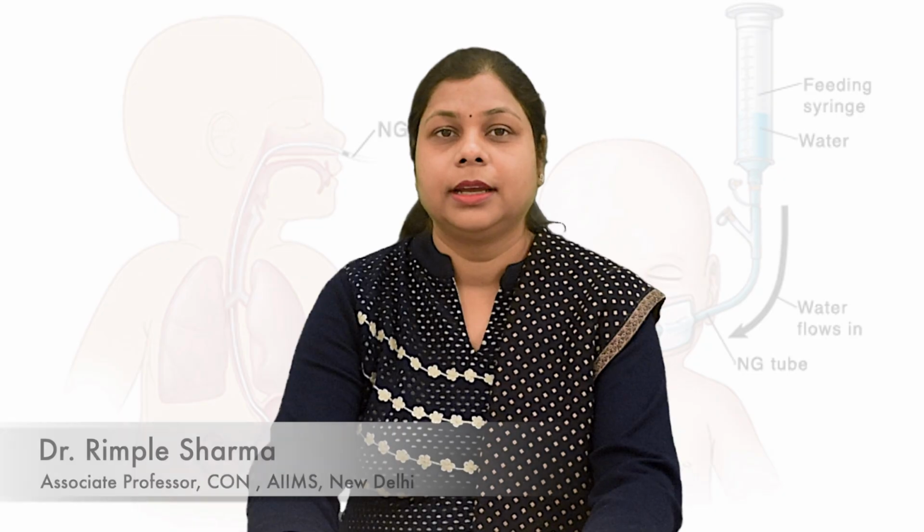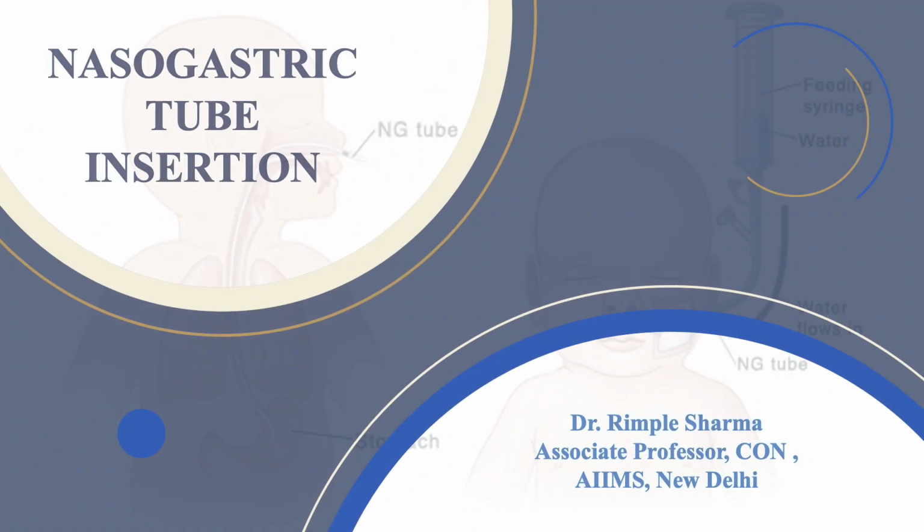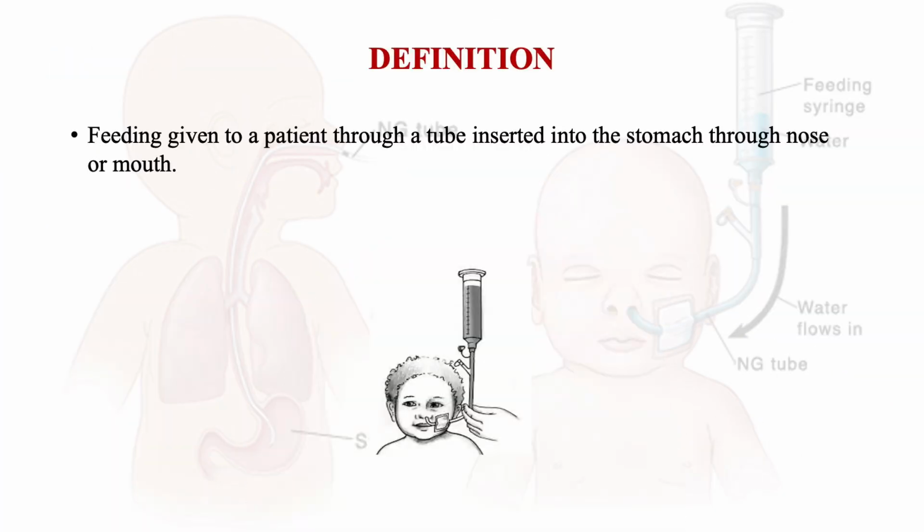Welcome learners. In this particular session, we will be talking about nasogastric tube insertion and feeding. Talking about the definition of the procedure, feeding given to a patient through a tube inserted into the stomach through the nose or mouth is known as nasogastric or orogastric feeding.